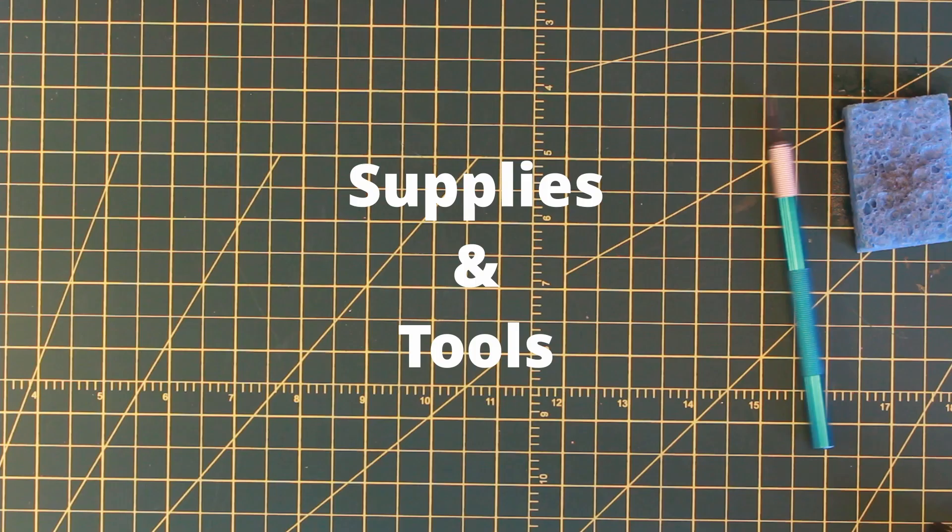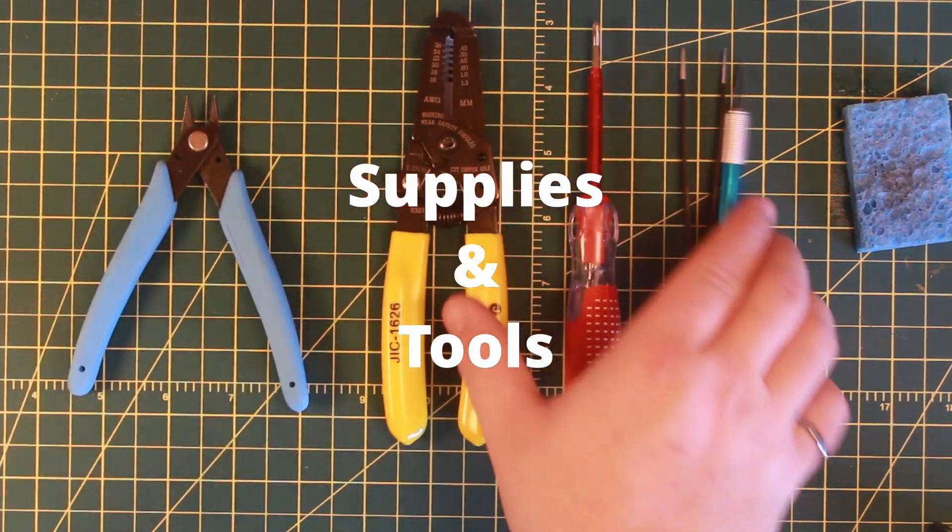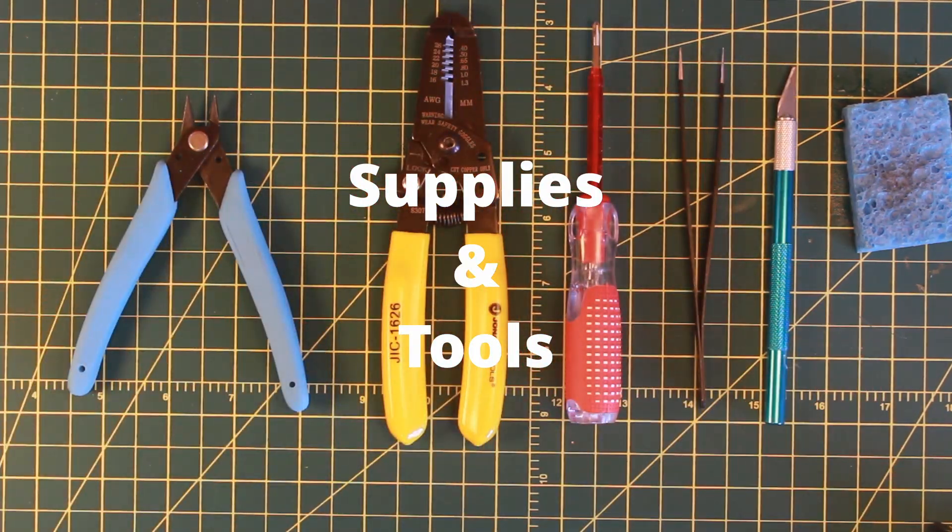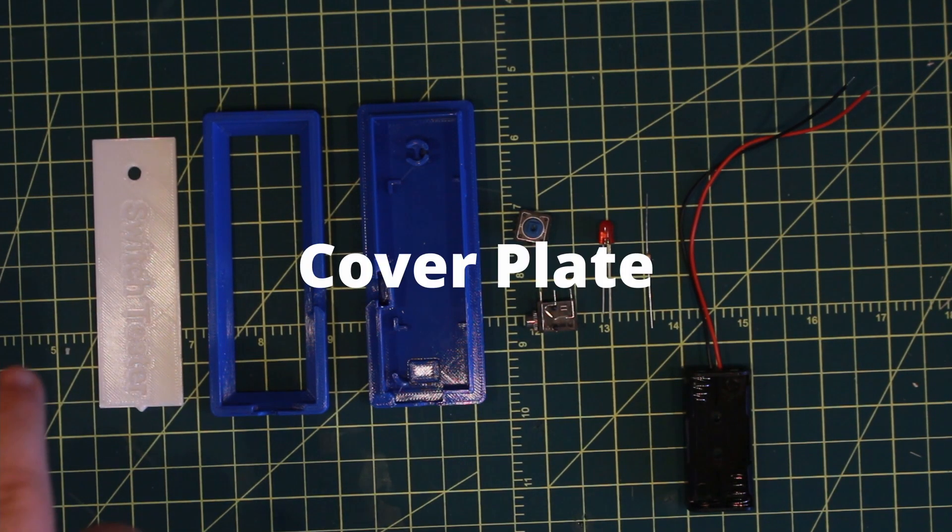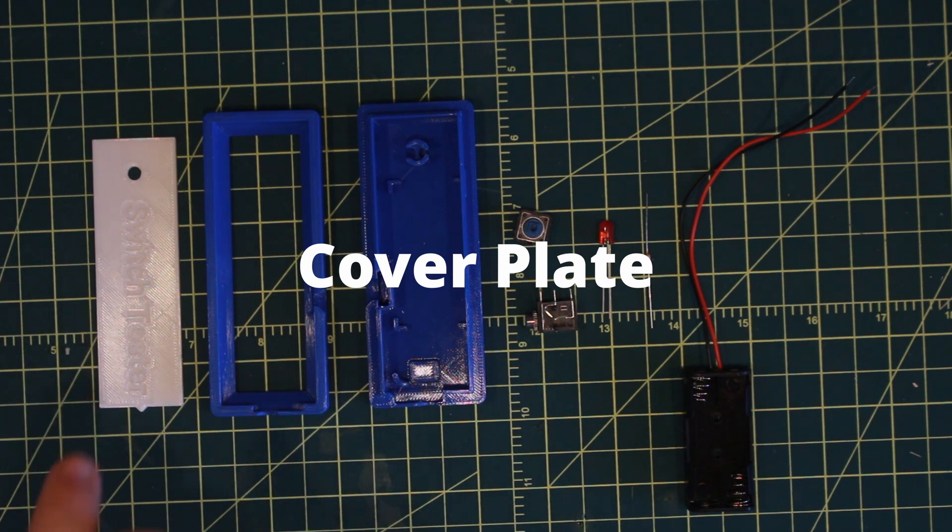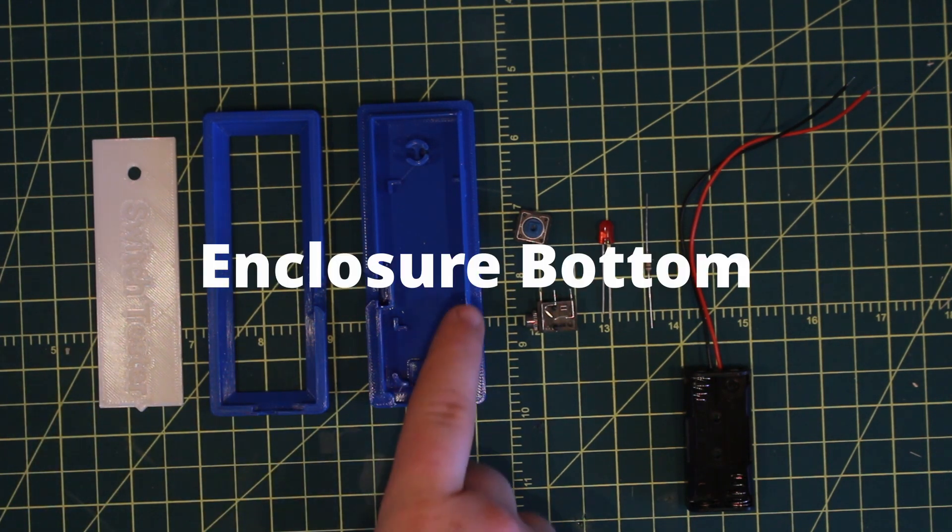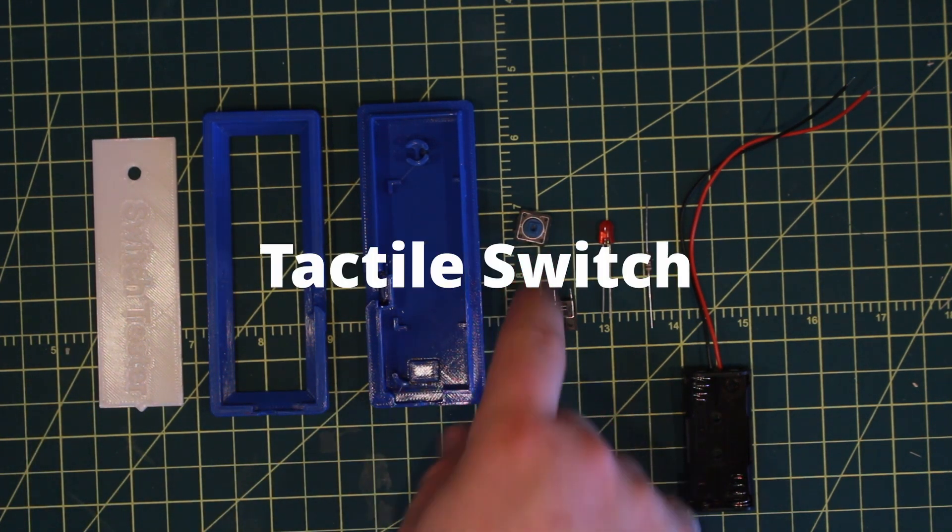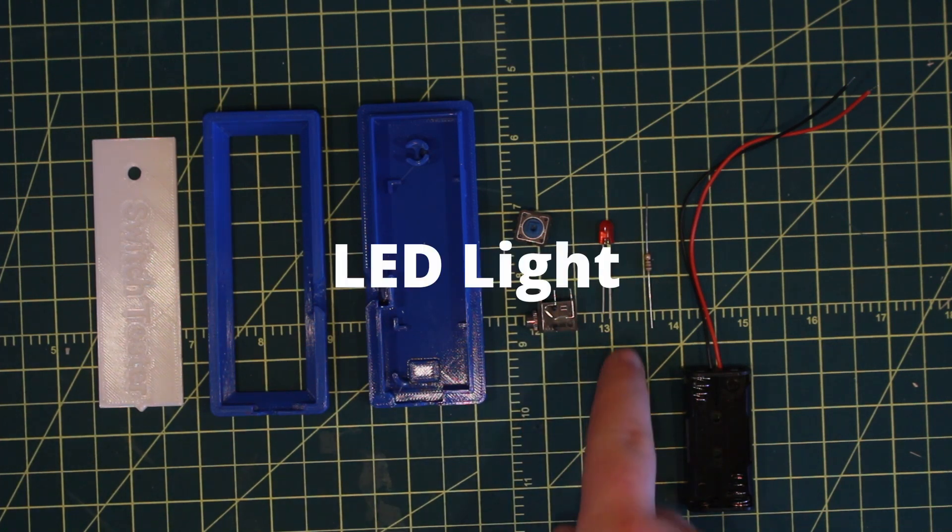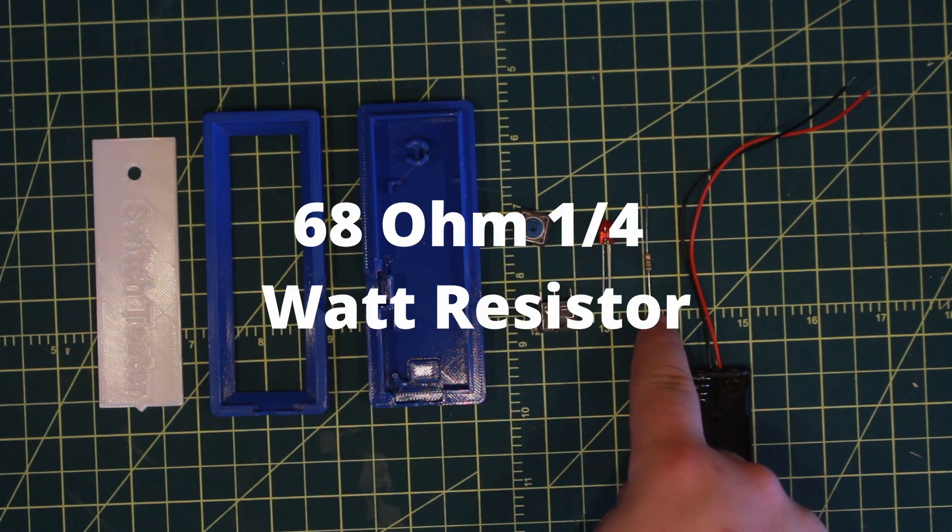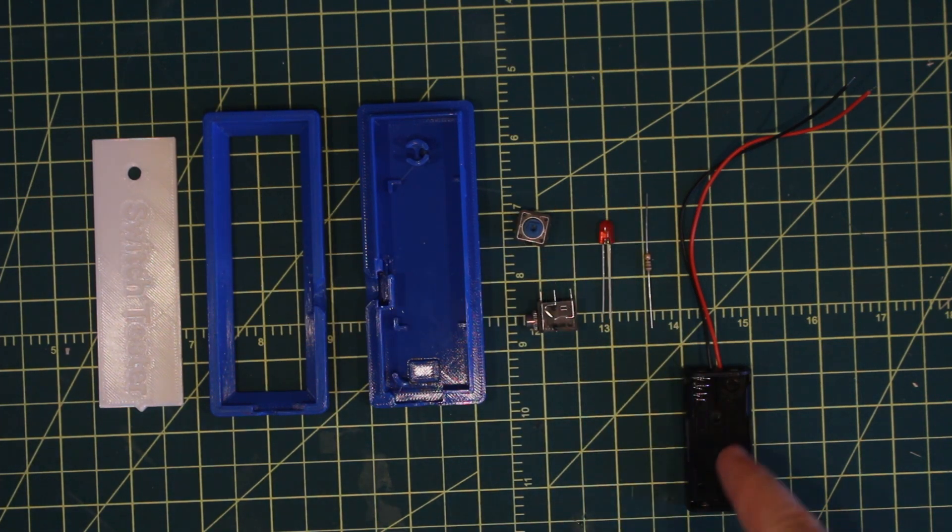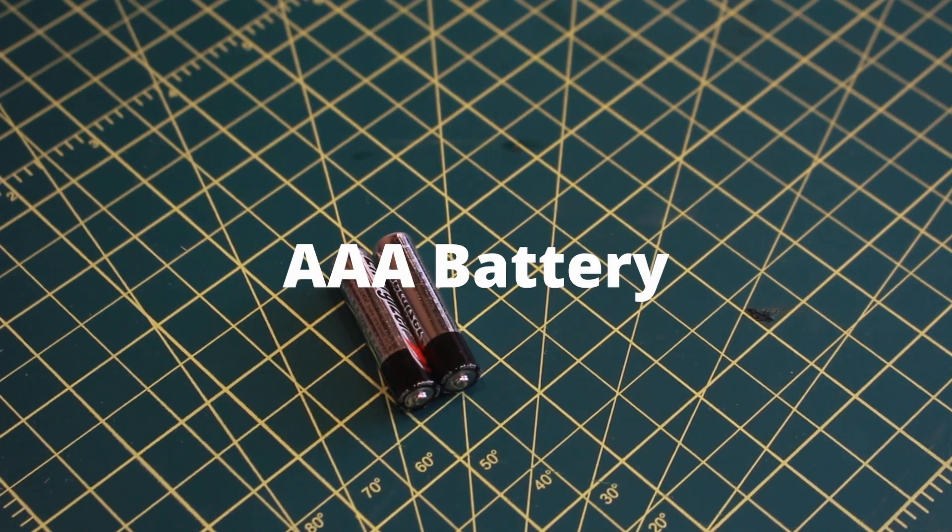First, we must prepare our workspace and get our supplies together. For the Switch Tester parts, you'll need the 3D printed cover plate, enclosure top, enclosure bottom, tactile switch, 3.5mm jack, LED light, 68 ohm quarter watt resistor, battery holder, and two AAA batteries.